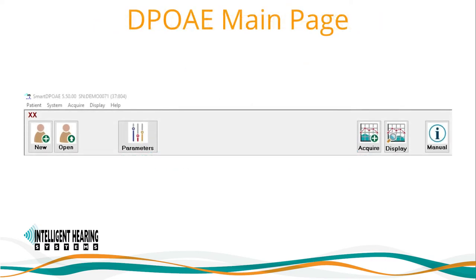Let's begin to review the Smart DPOAE program. On the main page, you have access to new or open patient, used to enter a new patient or load an existing patient, followed by the parameters menu where you can program all your testing protocols. The Acquire button leads to the Acquire screen where you initiate tests, and the Display button leads you to the Display screen where test measurements are loaded, compared, and data reports are printed from.